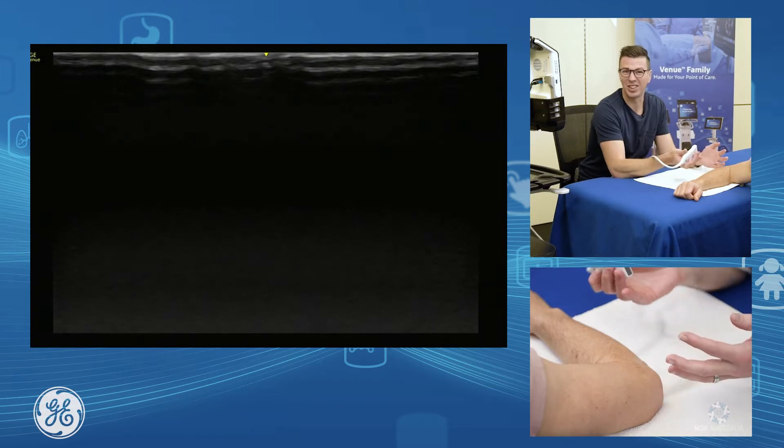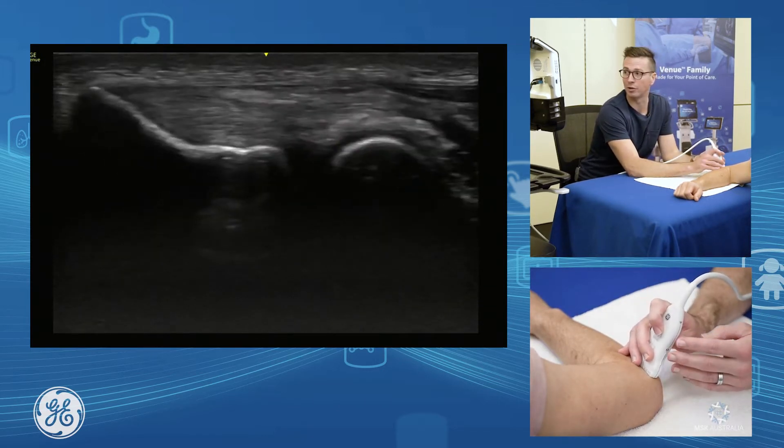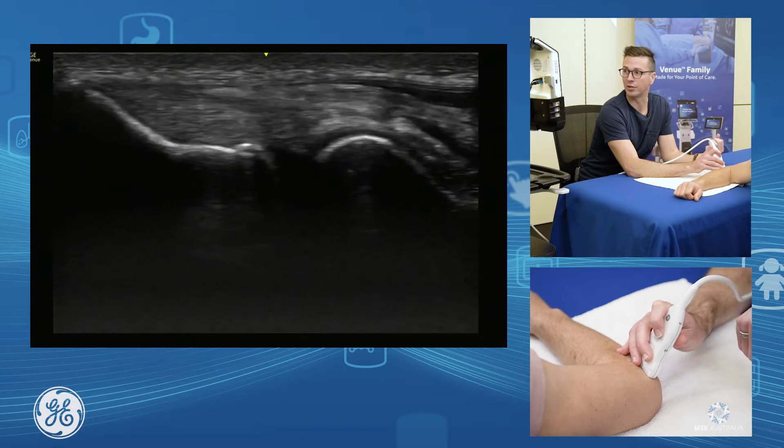The common extensor tendon is a really easy tendon to assess. We just grab our probe and pop it on in longitudinal along the tendon, and as we move through we can assess the bulk of the common extensor tendon.